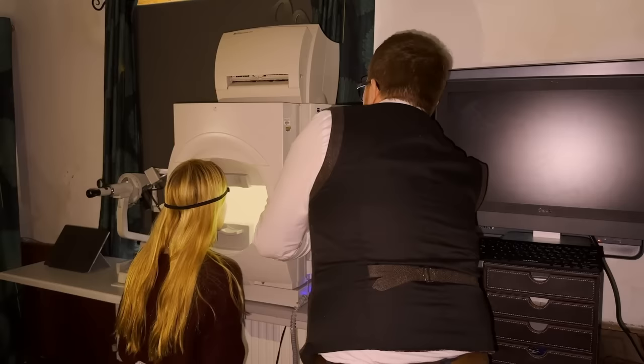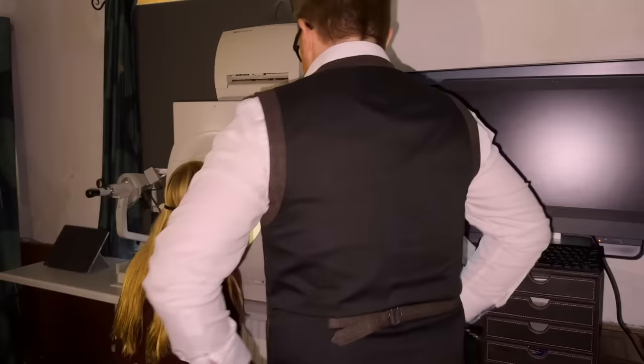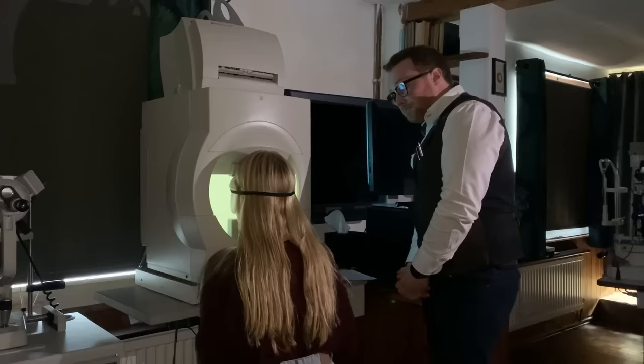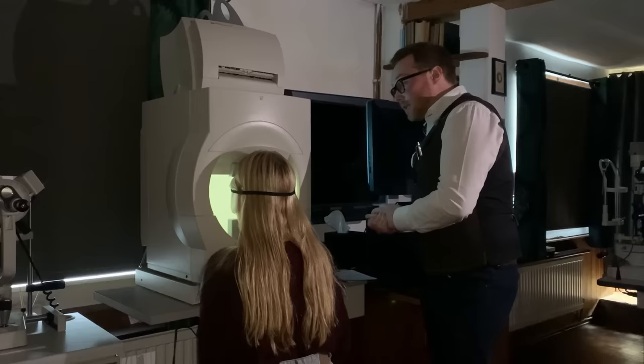Is that still comfortable there? Yeah. Perfect. Now, what I'm going to get you to do is look straight ahead. You should be able to see a little orange light straight in front of you. Throughout the test, keep looking straight at that. It's always quite difficult to keep your eyes still, but do the best job you can looking at the orange light. There's going to be some white flashes that appear all over the screen, and all you need to do is press the button in your hand whenever you see a little white flash for me.